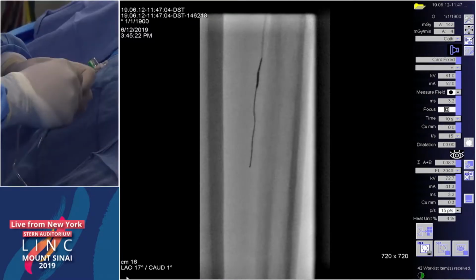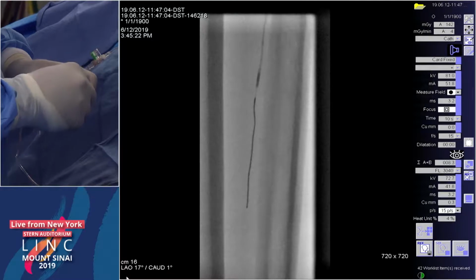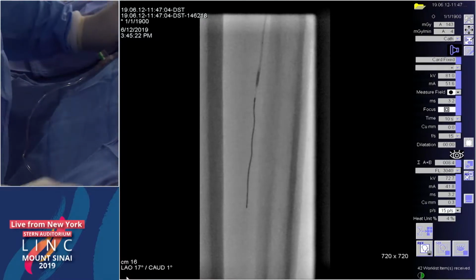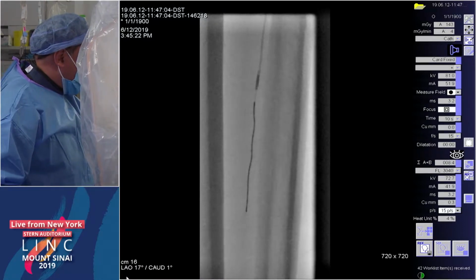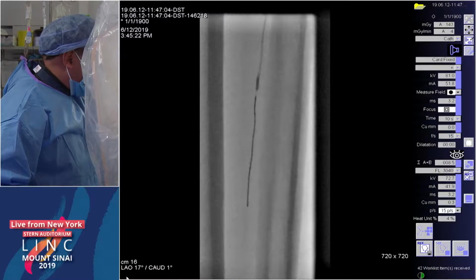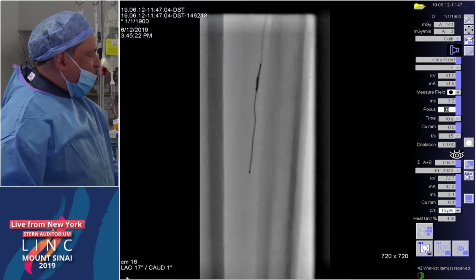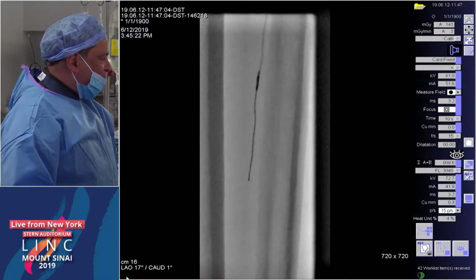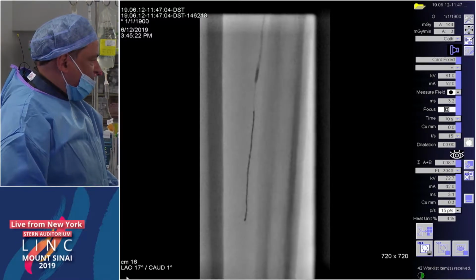Good. PK, what's that support catheter? It's got a radiopaque tip, a little angle, and a pretty nice, smooth taper. It's a Teleport catheter, Chris. CSI makes this catheter, and it has really changed our practice in these kinds of difficult cases. It allows us to track it down. They use it for coronary CTOs and transcollateral crossing, and our coronary team is quite advanced in those abilities.